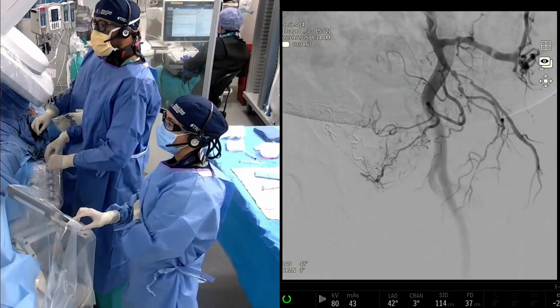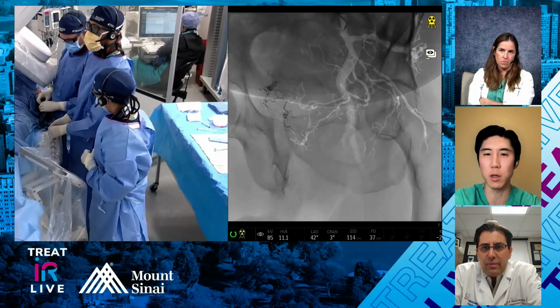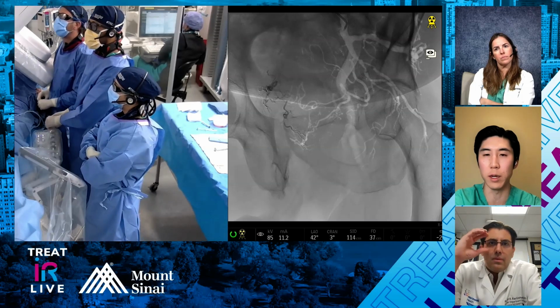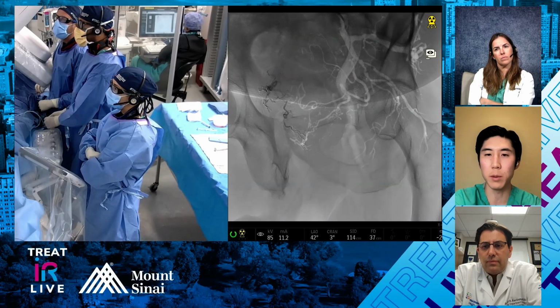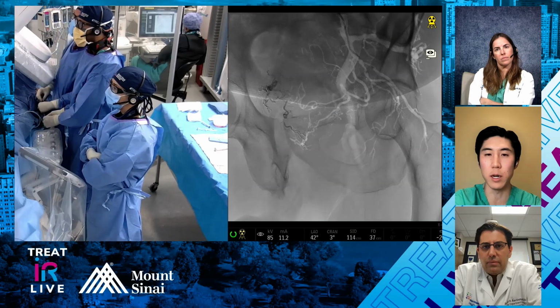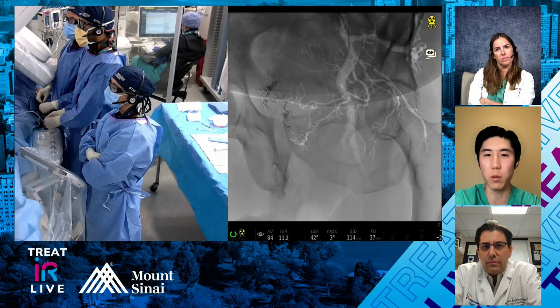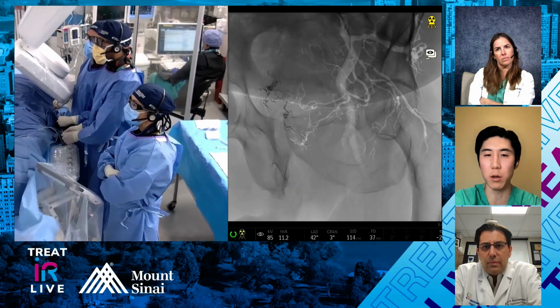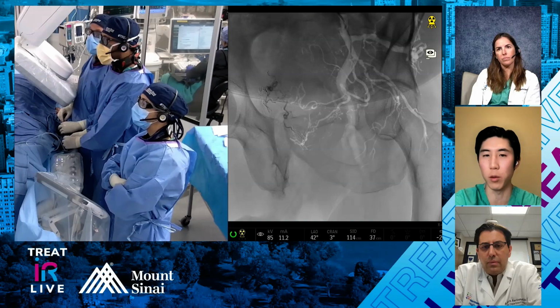I think whenever I see a diseased pudendal in general, I always am a little bit more cautious about what I'm looking at in terms of the prostatic artery, because there's usually always a collateral that goes to the penis then. And so whenever you see that, I think people need to be a little bit careful when they're looking at the prostate and look for those shunts, those accessory shunts that go to the pudendals, and make sure that they're not going to inadvertently have non-target embolization. But to answer your question, I think the superior one is probably more of the anterolateral central gland branch, and the inferior is probably going more to the posterior base of the gland, is my suspicion. But I think both go to the prostate gland.